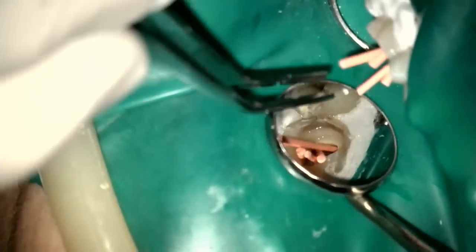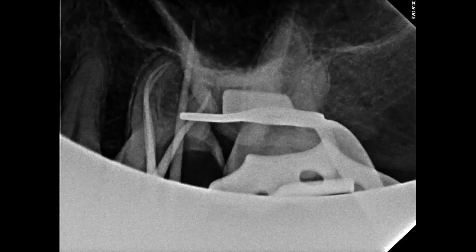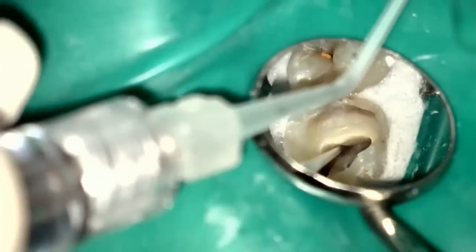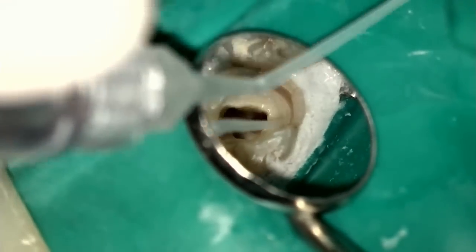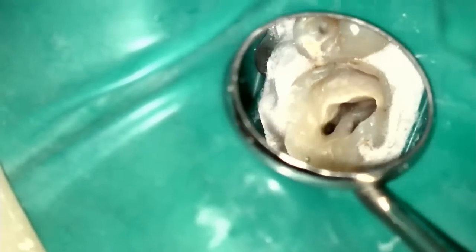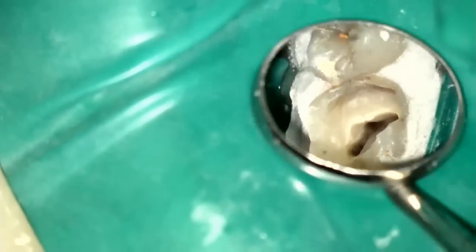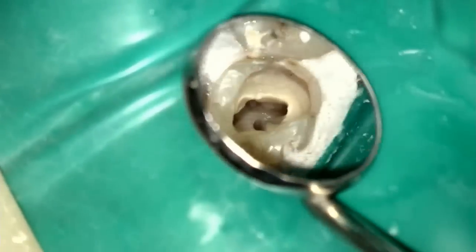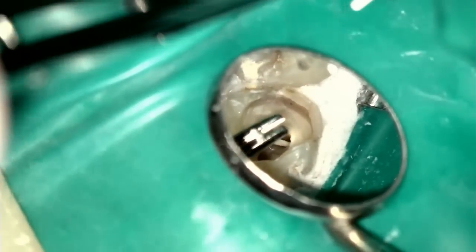Once shaping is complete, we fit cones and take an x-ray to confirm working lengths. Everything looks okay and we proceed to seal. I'll flush the canals one more time and use my microsuction to initiate drying. This microsuction is amazing because it really means you only need to use a few paper points — you don't have to use 15 boxes of paper points like we used to. The paper points go in, and once they come out dry, we're about ready to start sealing it up.